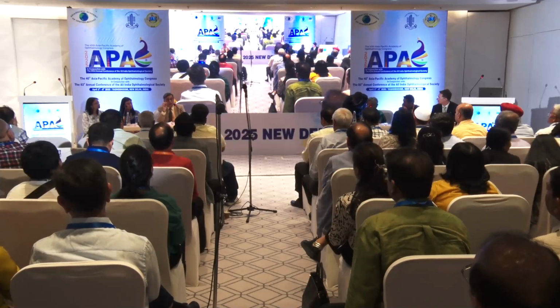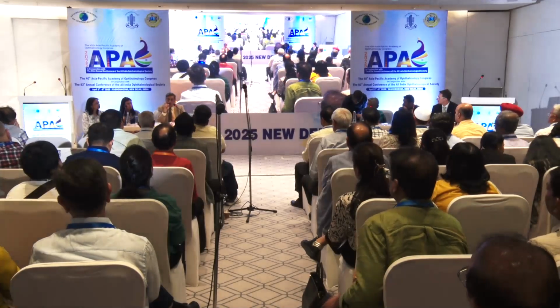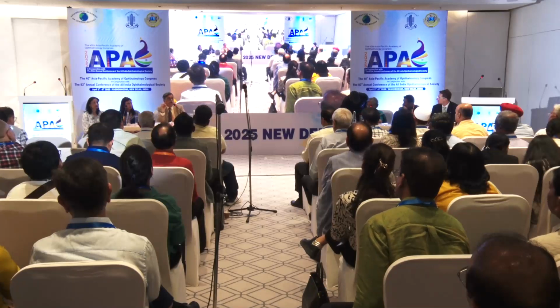Today, we are not replacing your clinical acumen with a machine. We are increasing the ability of your eye to see the ultrastructure of the eye.